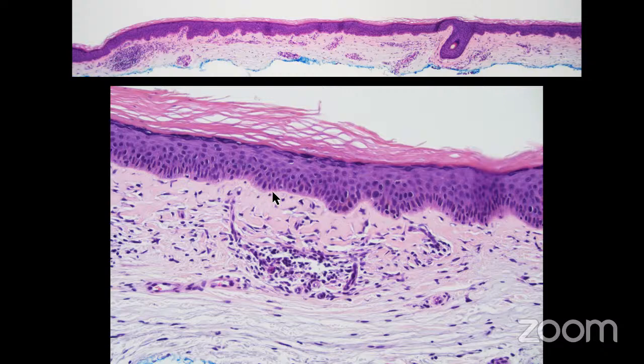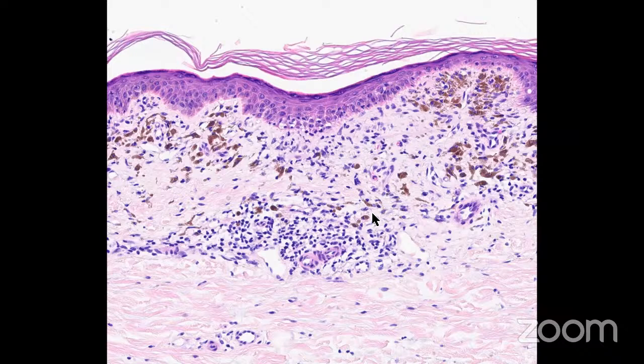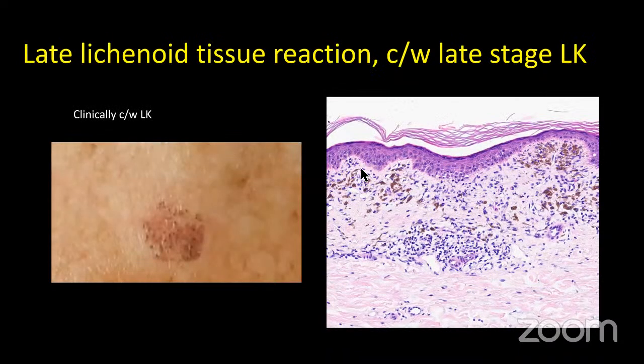There's some vacuolar change, but you can see that the dermis has this smudginess that probably represents some chronicity, and then also some colloid bodies there. And later stage, as I mentioned, you'll have a lot of pigment, you'll have some alteration, pigment dropout, and you might not have the infiltrate there as well. And so this image here could be seen in a regressed melanoma. You've got some tumoral melanophages here. And so sometimes we can't tell if it's regressed melanoma or not.